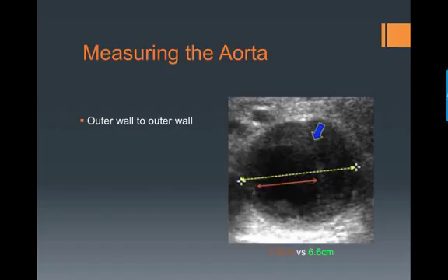If you see the blue arrow, you'll see that it's indicating the thrombus. The yellowish line indicates outer wall to outer wall, which is measuring 6.6 centimeters — so that does indeed confirm that there is an aneurysm present. Now if you were to mistakenly measure inner wall to inner wall, as indicated by the orange arrow, you would be undermeasuring the aorta.